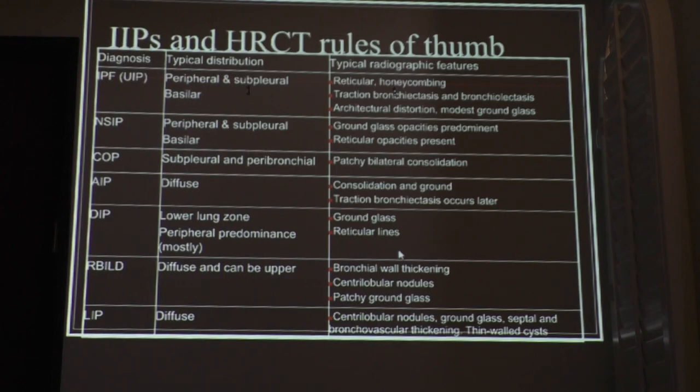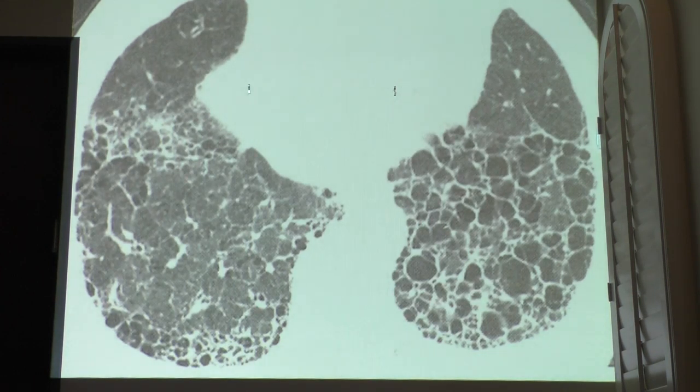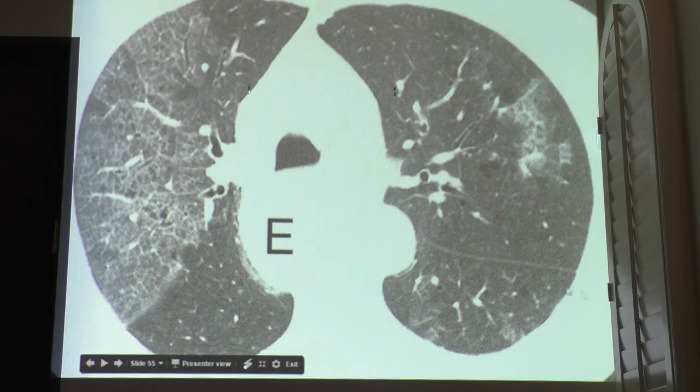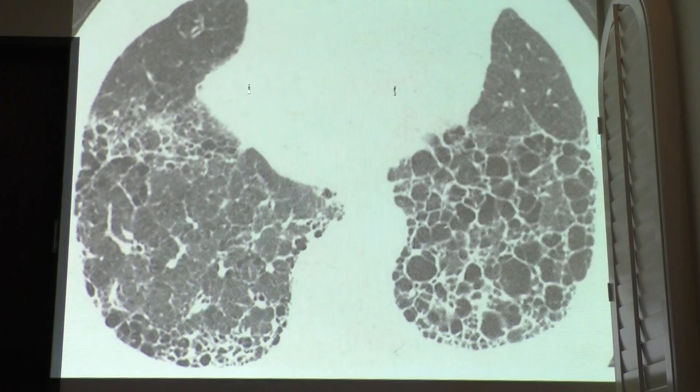I'm sorry? It's different. I don't know exactly how to tell you how they're different, but ground glass is more like this, yeah. So ground glass is inclusions, whereas reticular is like fibrosis? Reticular kind of looks like strands or filaments. Wispy, and then ground glass, not like wispy, it's more like, you know, how do I put it? Yeah, kind of more like spider webs.